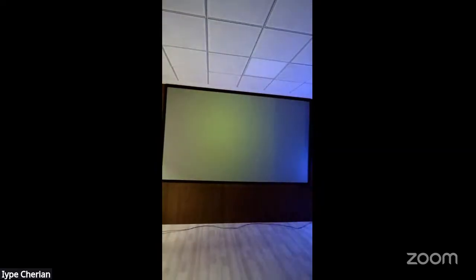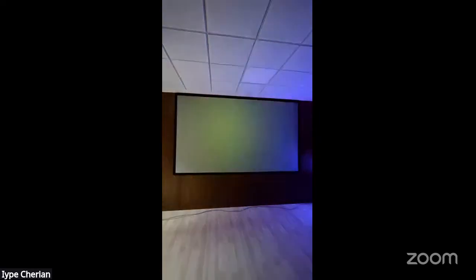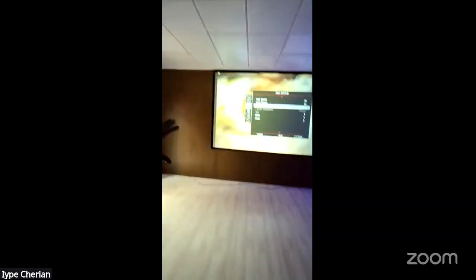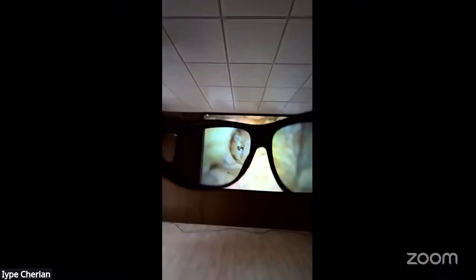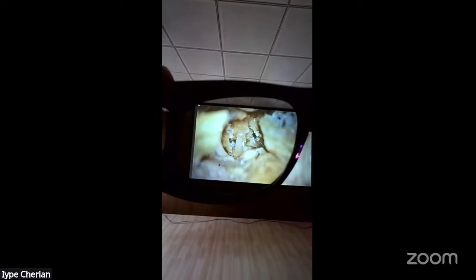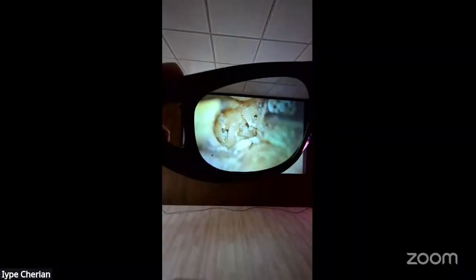Just 1 minute, John. I am here, and we are now transmitting the dissection room video to this place. And you can see the same thing that we transmitted through the 3D glasses. We are trying to show you somehow. And this is the immersion view of the third nerve, what you can see over there.